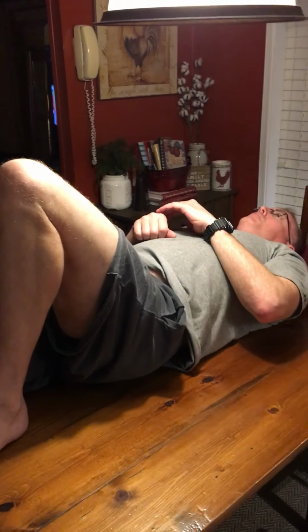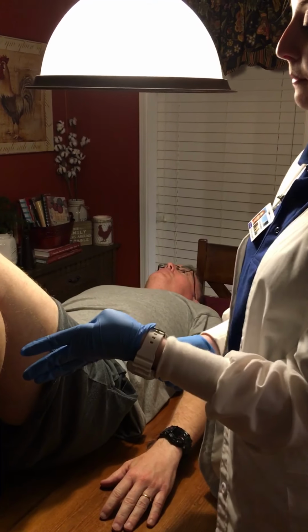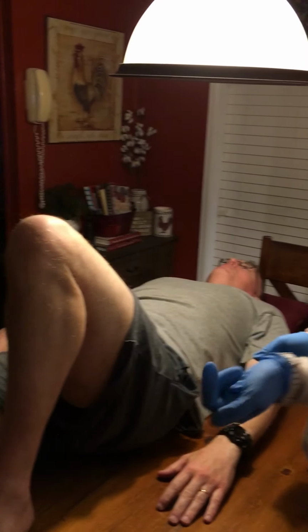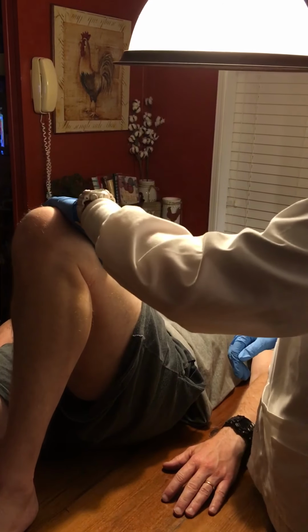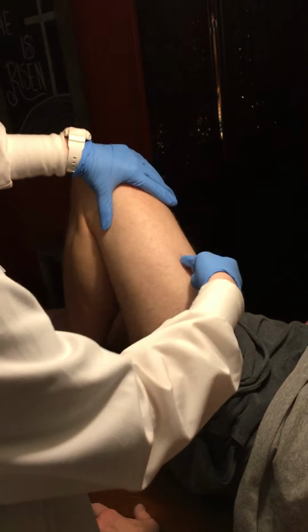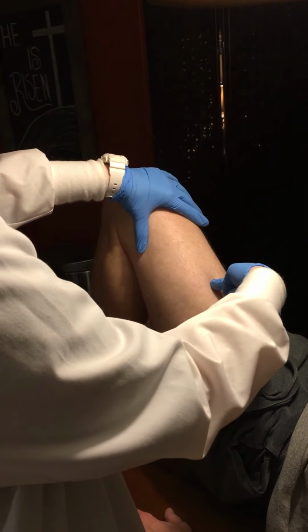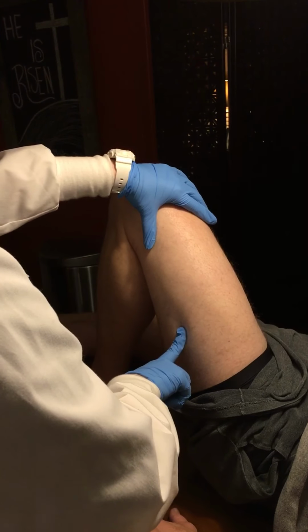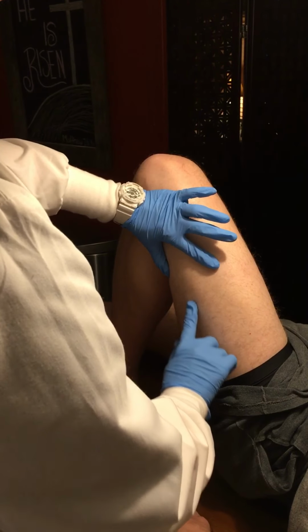Okay, you lie on your back now, and this is the vastus lateralis site. So you want to have them have their leg bent with the leg that you're going to be giving the injection at. Now place one hand above the knee and one hand below the greater trochanter of the femur. And I'm going to find the midline of the anterior thigh, and then the midline of the lateral thigh. So it's going to be about in this area. That's the injection site. And then the last one is his deltoid.